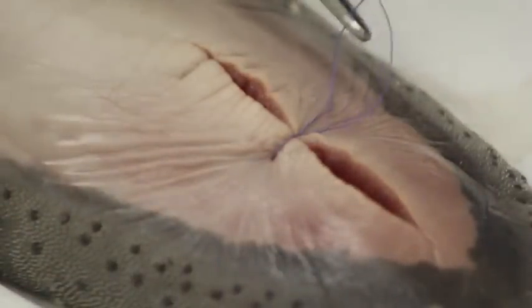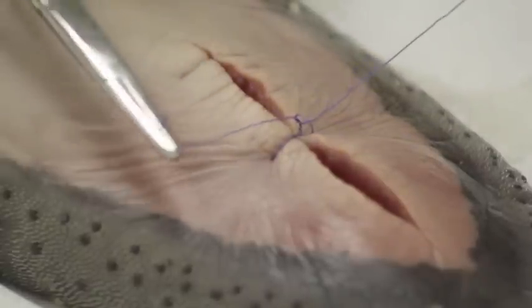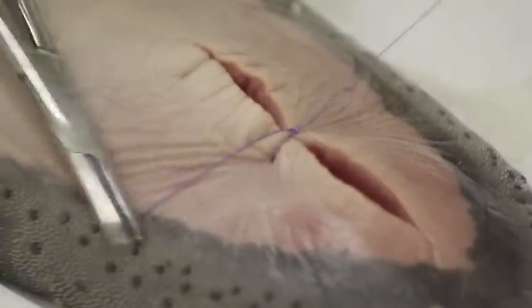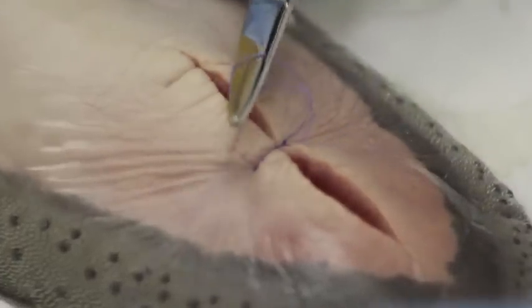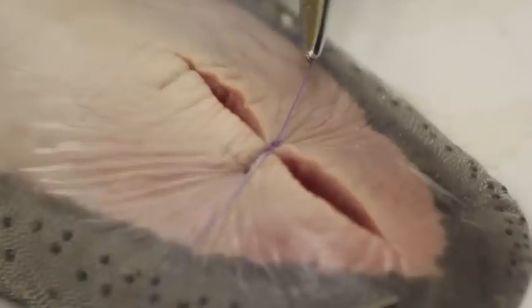Now we go for our square knot and we need to come back. See how I cross my hand — see how it's flat again in the middle. Wrap it once and see how I come down flat.